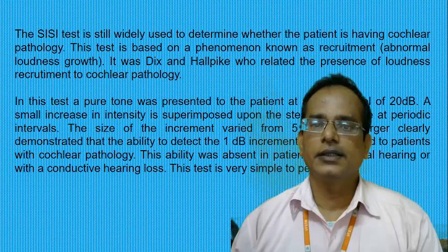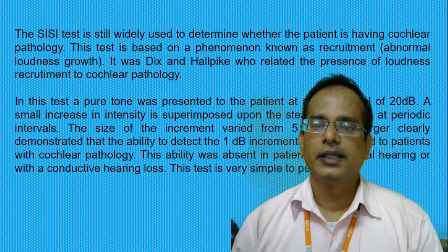So here, the SISI test is still widely used to determine whether the patient is having cochlear pathology. This test is based on a phenomenon known as recruitment, abnormal loudness growth. It was Dix and Hallpike who related the presence of loudness recruitment to cochlear pathology.